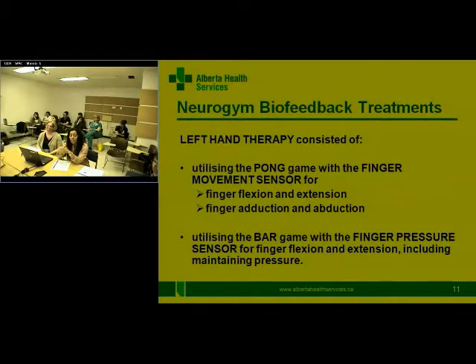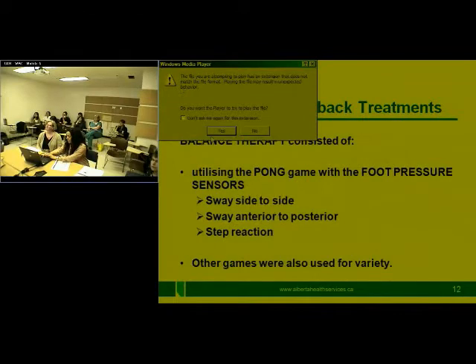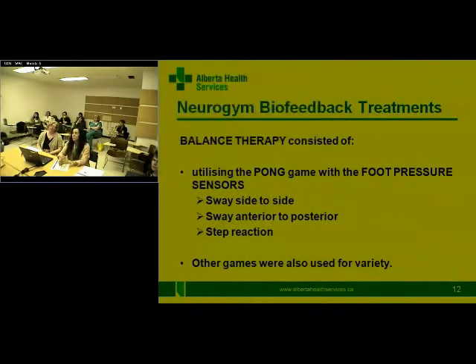We also have a few other games in the biofeedback machine where we try a variety of games. We have a bar game that this client enjoyed, and in that one, he needs to get that bar moving to stop underneath a block that changes the color in his scores if that bar changes to green. So it's a color kind of game. And we actually had some video that we were going to try to present, but it's not working for us, sorry.